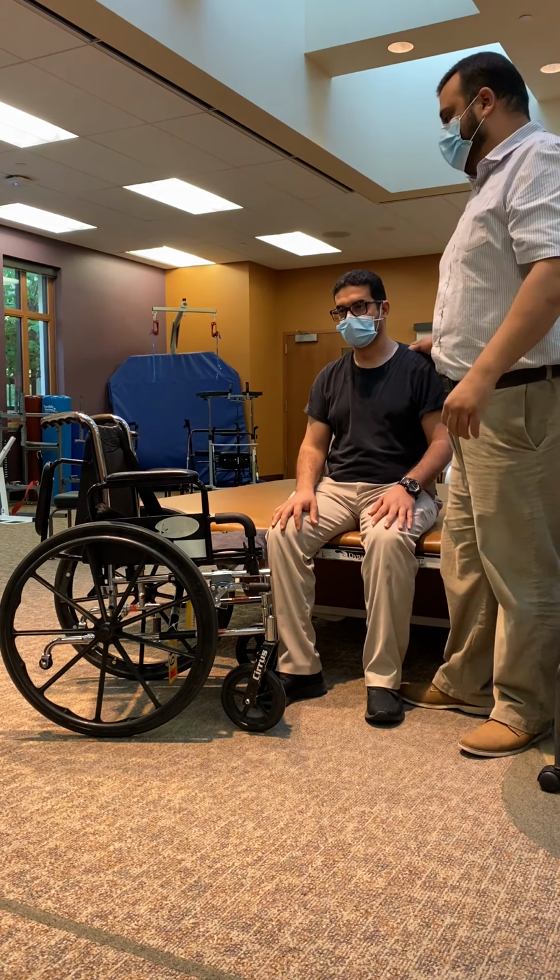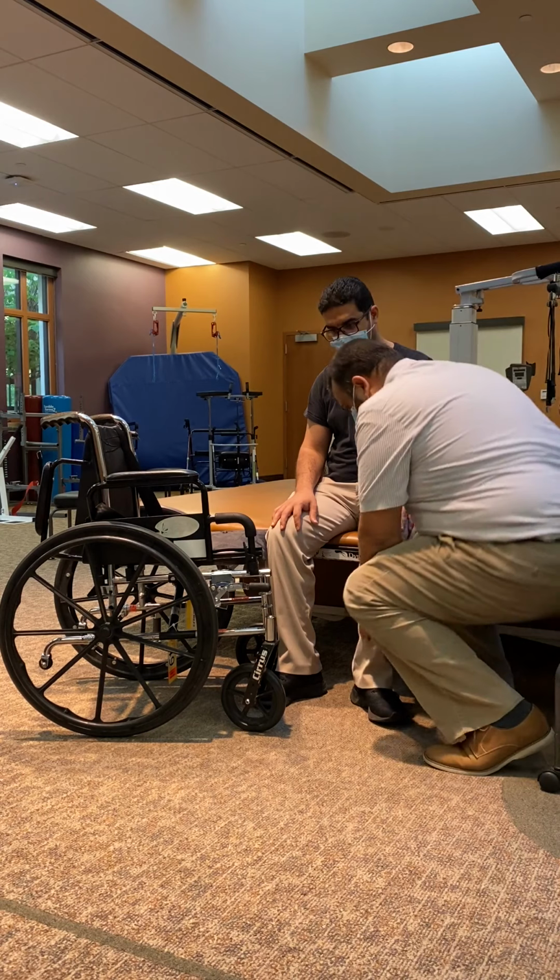Also, the feet have to be guided through the transfer. So I use my foot to guide his foot as we transfer, or both of my feet to guide his affected side foot as we transfer. And I will place it ahead of time on the side we're transferring.